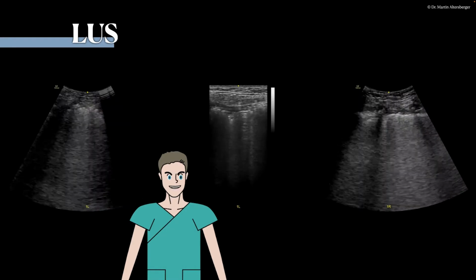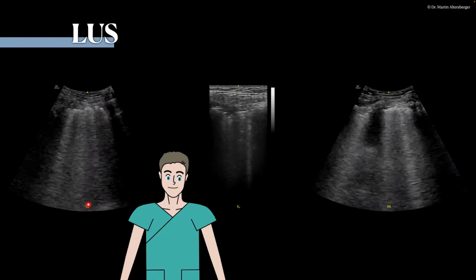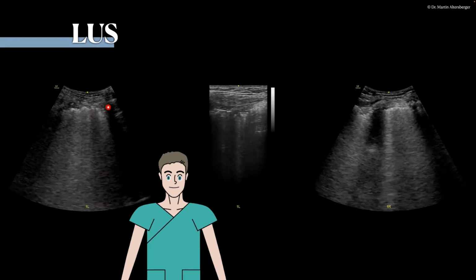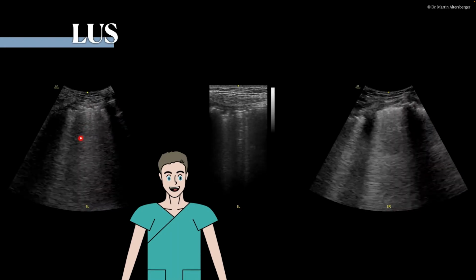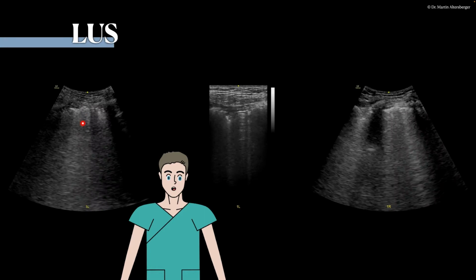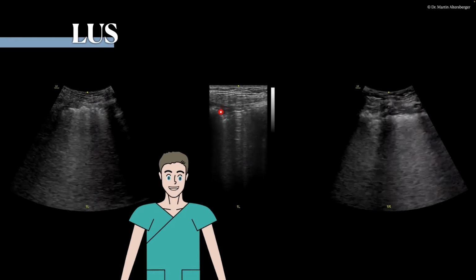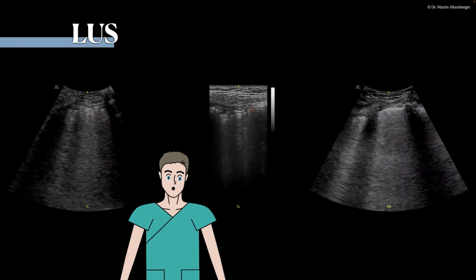Of course, adding lung ultrasound makes the picture even clearer. We have here parts of the lungs, in the anterior field on the left side, again on the left side with a linear transducer, and here on the right side. We see that the lung surface, or the pleural line, is irregular. It appears thickened, and we have plenty of so-called reverberation artifacts. In this case, comet tail artifacts arising from an irregular pleural line. We see this with the linear transducer as well, that it's truly irregular. There are even some small consolidations, these grayish areas, and this irregular pleural line.